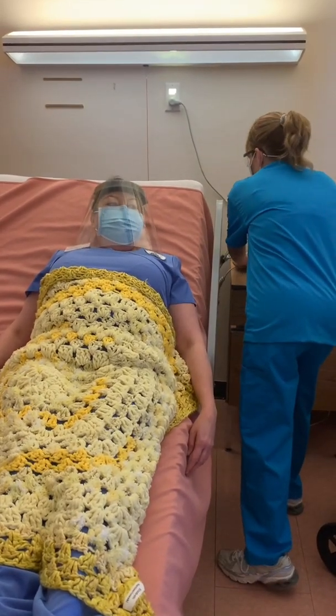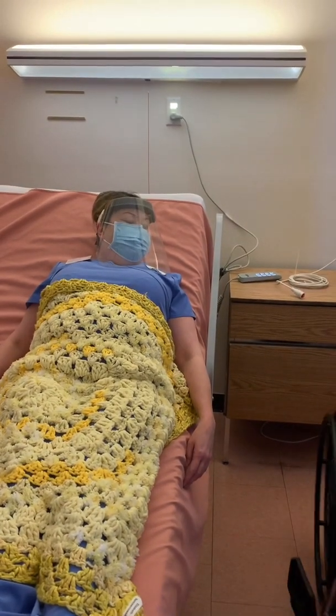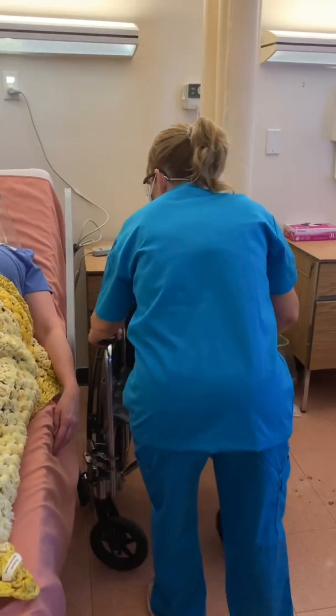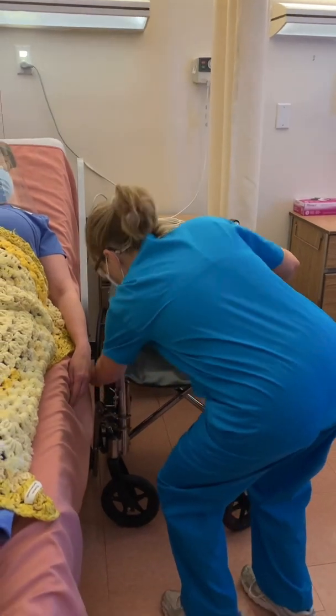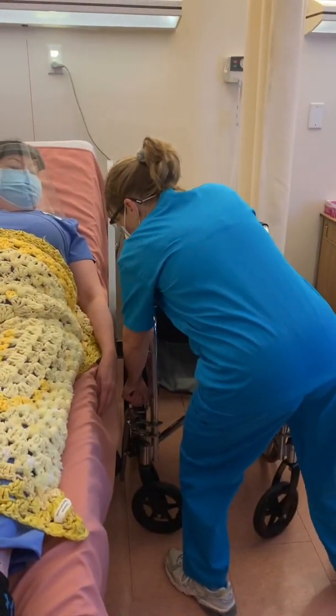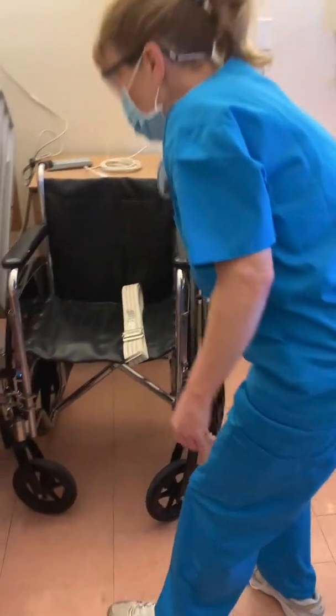Okay. So before we begin, I'm going to make sure my equipment is in place. I know that the wheels are locked on your bed already. I'm going to position the wheelchair as close to the bed as possible. And I'm going to make sure that the wheels are also locked on the wheelchair before we begin. You'll notice I've moved the foot rails out of the way.